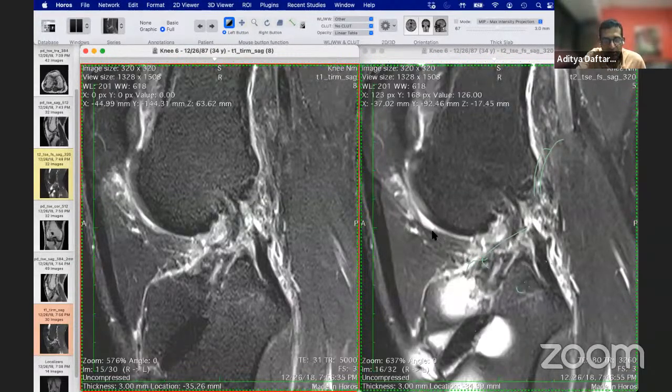Okay, I think we've answered most of those questions. So internal derangement, you would say PD, PDFS, T2FS.